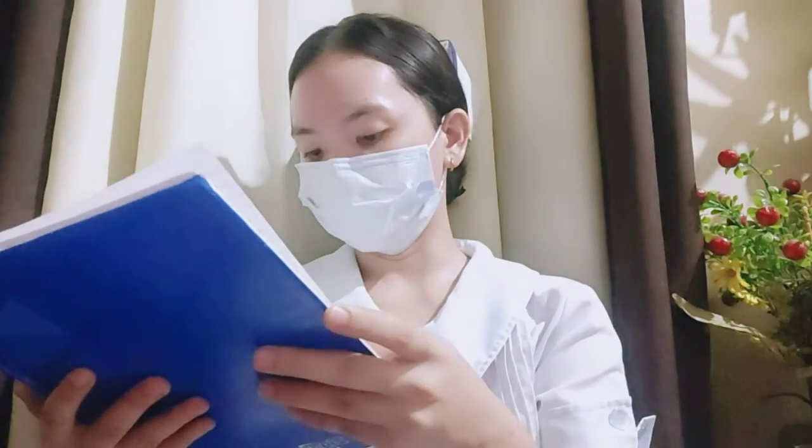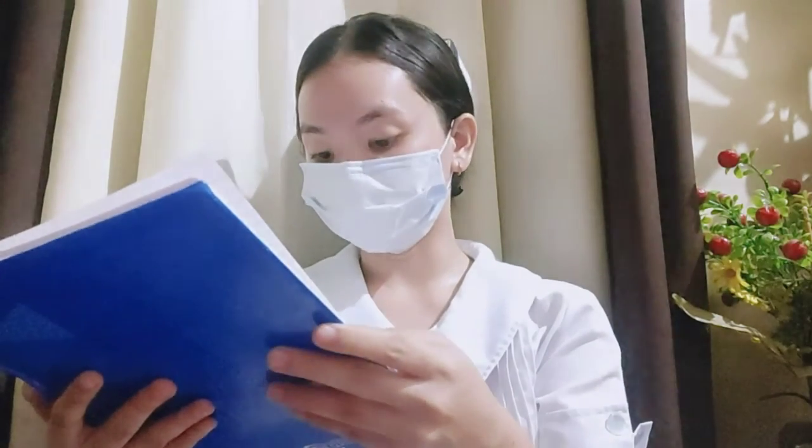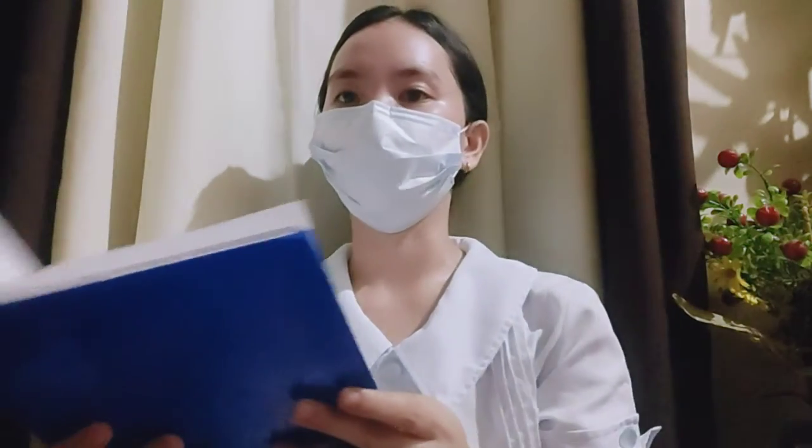And for the health teaching, patient received oral care at 2 to 4 hours interval. Lubrication for lips is also given, and anesthetic spray for throat irritation. That's all. Thank you.